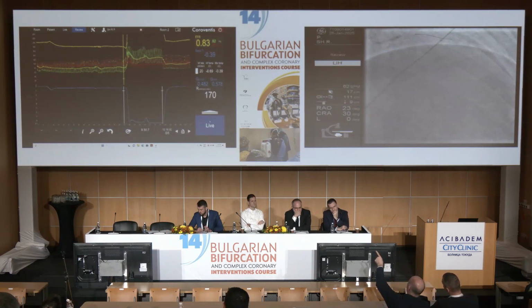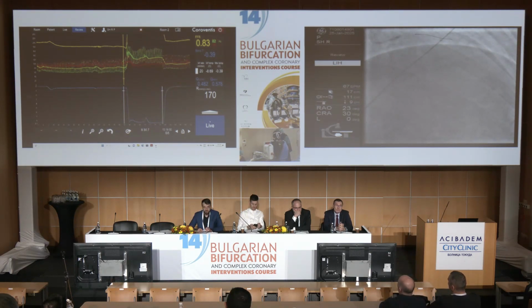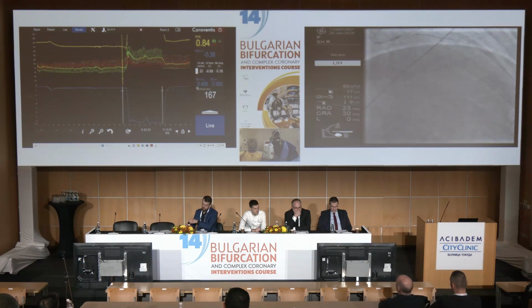Okay? So you have everything just in front of you. I think I've done probably these recordings thousands of times, thousands. But still, I'm flabbergasted by several things. First, how stable these signals are, how reproducible they are, how perfectly stable, but also look how accurate and precise these things are. And you can go like this. And what did we see?